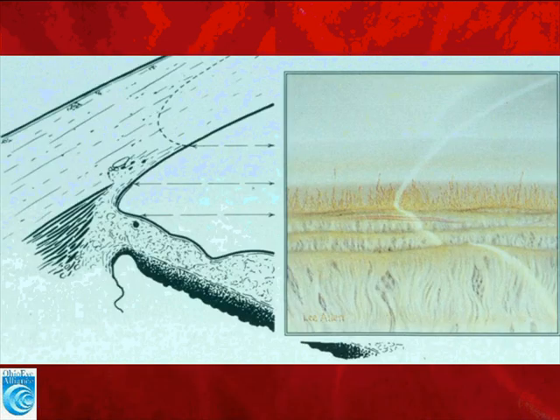In this case, we see some normal appearing angle vessels. They are fine, they are not really branching, and only occasionally do they cross the scleral spur. In this case, again, we see some very fine, regular appearing vessels in the angle. These do not cross the scleral spur.